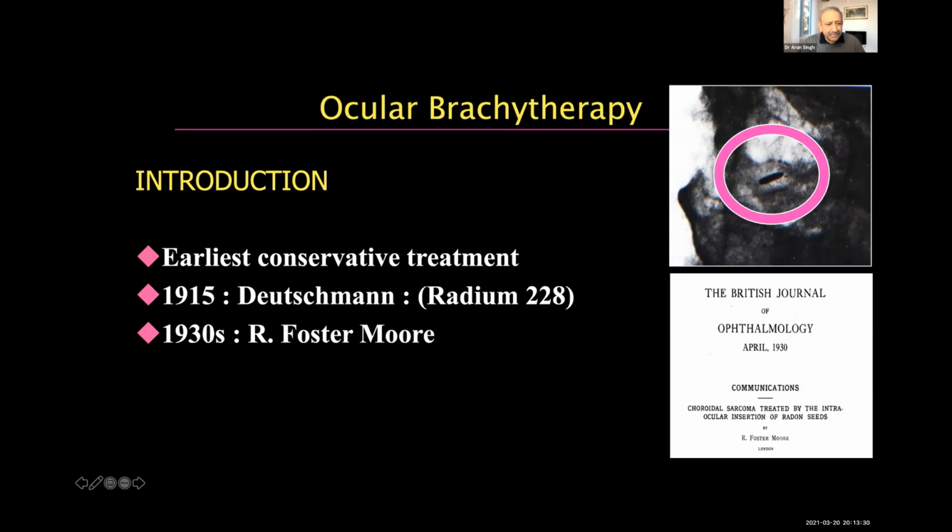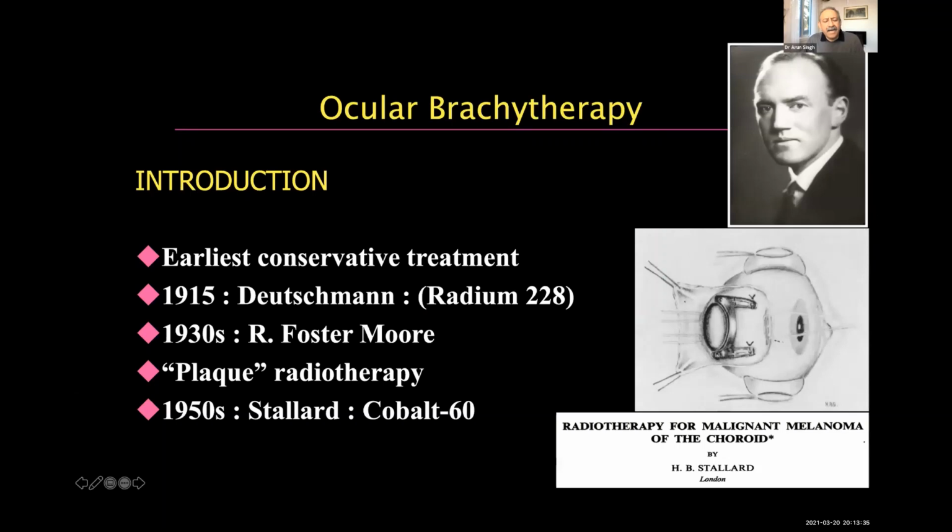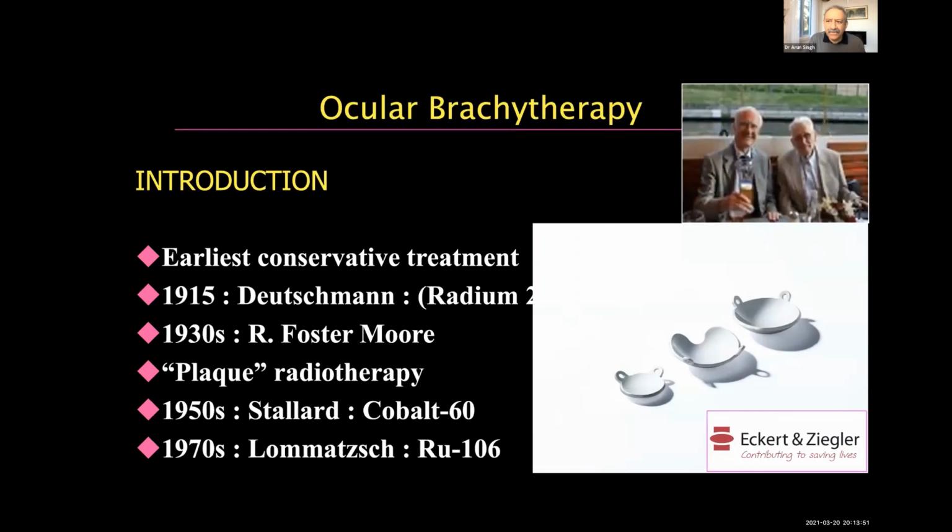And then, of course, there have been other people, notably Stallard, who came up with the present-day design of the plaque as we use it, and that's cobalt-60. And he published that article in the 1960s. And then, of course, we have from Germany, Peter Lommatzsch, who designed the ruthenium implant, and the Eckert & Ziegler company, of course, is based in Germany.